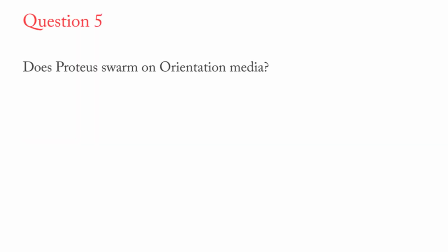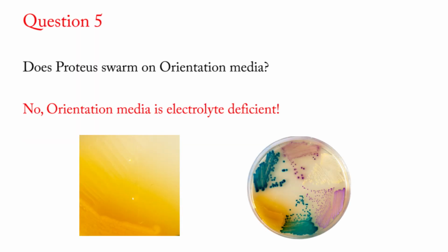Question 5. Does Proteus swarm on this media? No. Orientation media is electrolyte deficient, which prevents the swarming of Proteus. It will have an isolated appearance on orientation media, allowing for other growth to be clearly visualized.